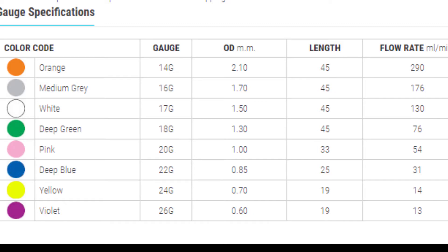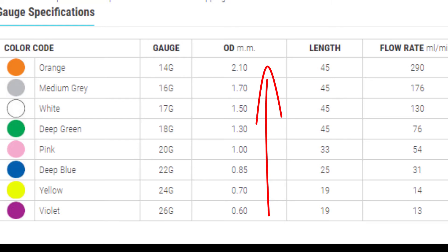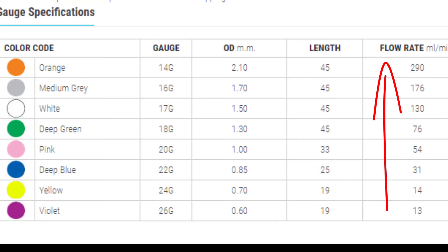As the number of the gauge decreases, the diameter of the cannula increases and flow rate also increases. Yellow and deep blue cannulas are usually used in the pediatrics department.